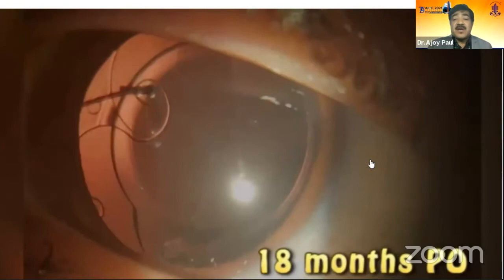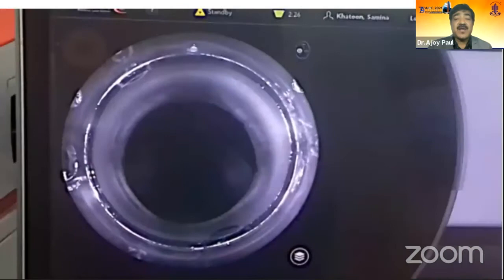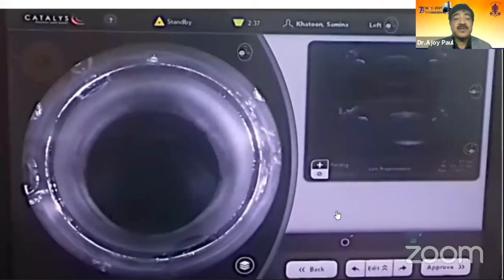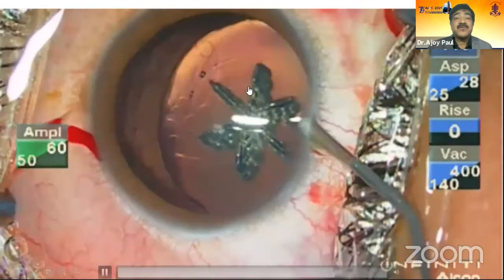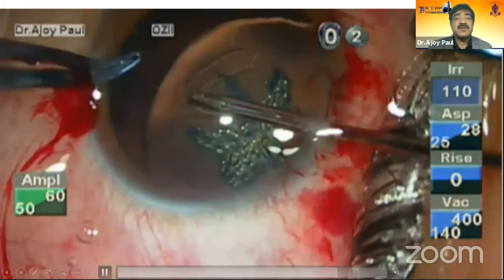Well, we have seen nice cases, but it is not always hunky-dory. In this case, as you can see, the femto may not always be useful. As I'm trying to do it in the periphery, I've got my rexis there. See, it's an incomplete rexis. So all I have to do is hold it with the rexis forceps. And once that is done, the rexis goes a little bit to the periphery, but somehow I did manage this case.